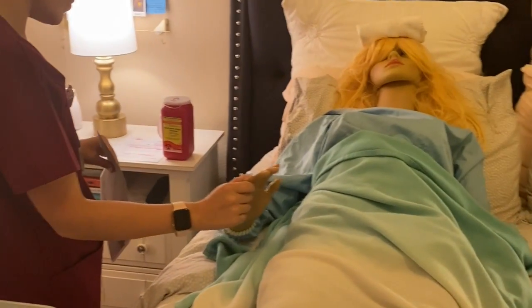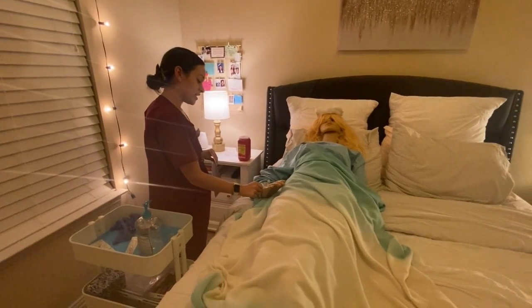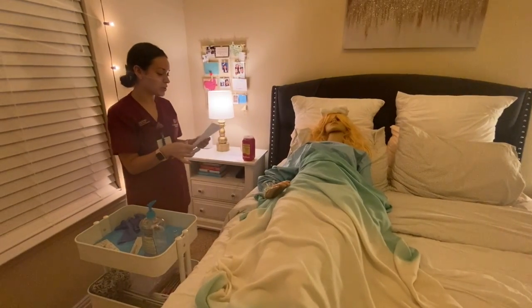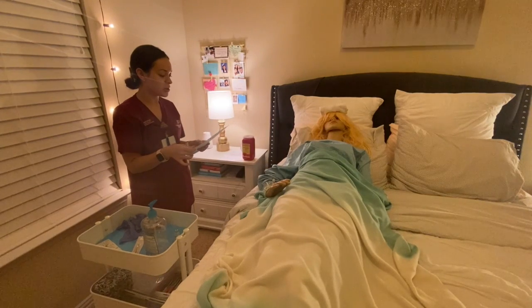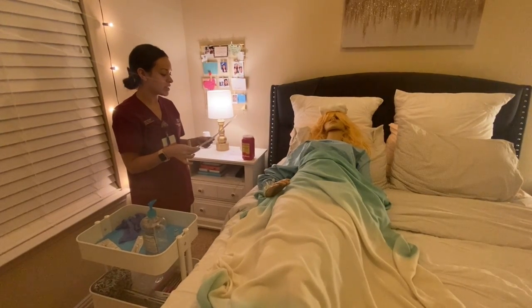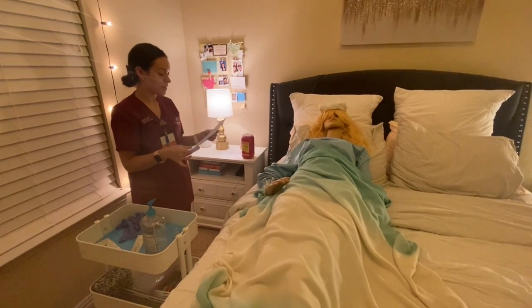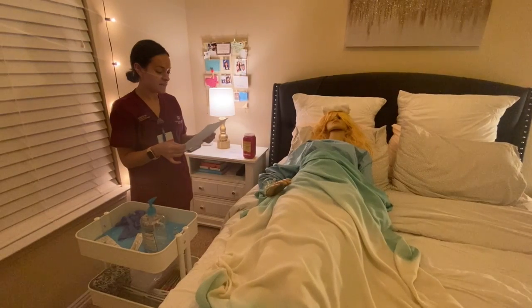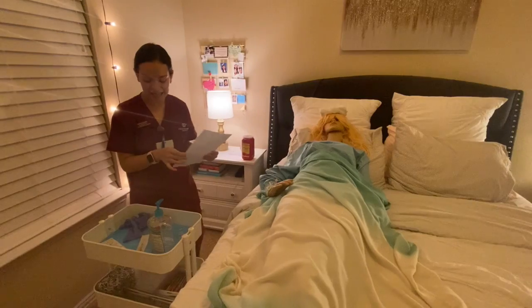Okay, great, Mrs. Winthrop. And I see that you don't have any allergies. Is that correct? Okay, great. I'm just going to verify the order with you. The MD did order that I administer your regular insulin and NPH insulin, okay? Okay. I'm just going to match this to the MAR before we begin.